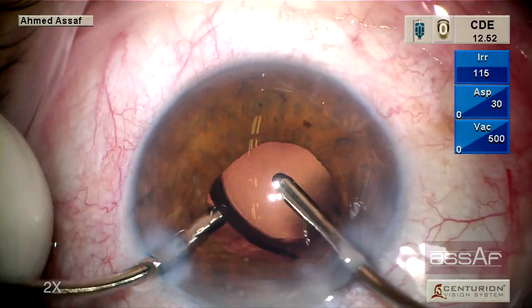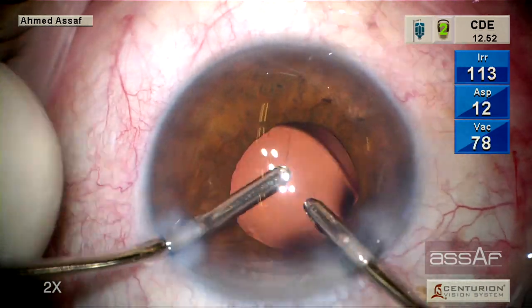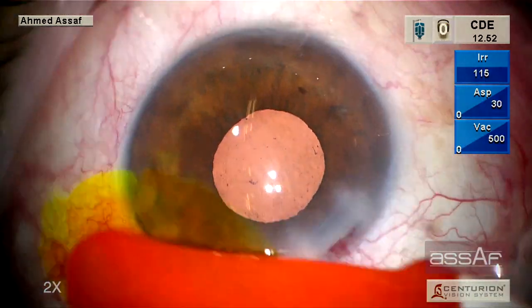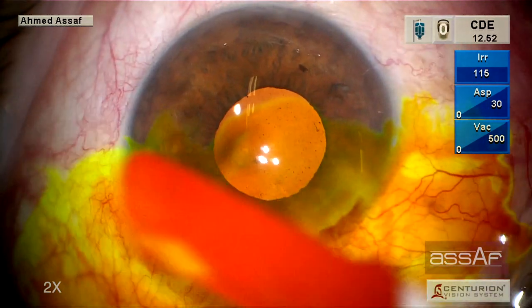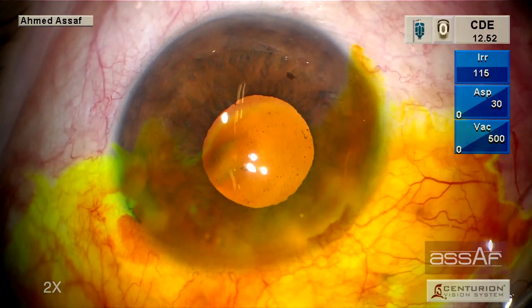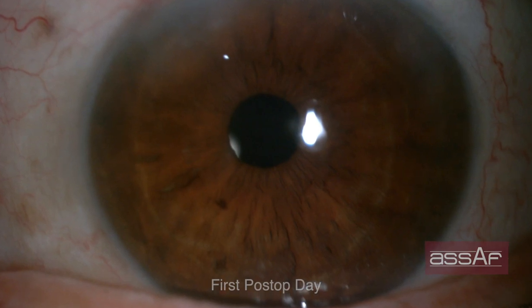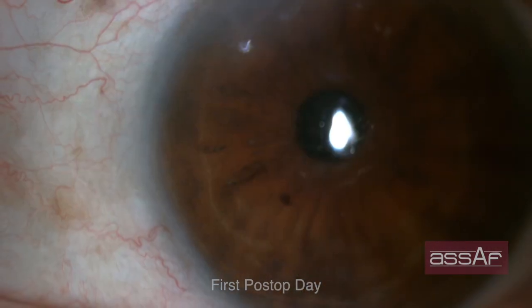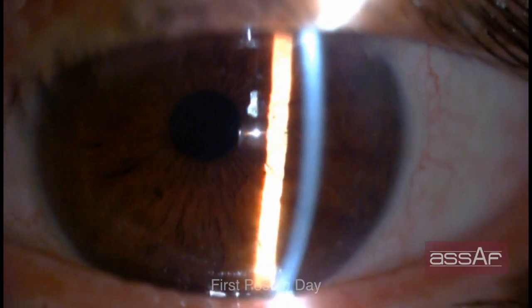We still have some cortical fibers to address — no problem. Before conclusion of the surgery, we test the self-sealing of the wounds. The main wound is self-sealed and does not need any stromal hydration; only the side port requires stromal hydration. This is the first post-operative day. The patient is very pleased with the outcomes, and the cornea is crystal clear with very mild corneal edema toward the center that resolves completely within a few days.